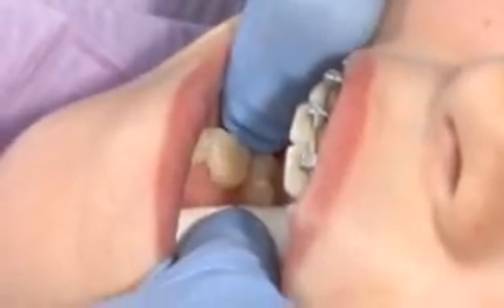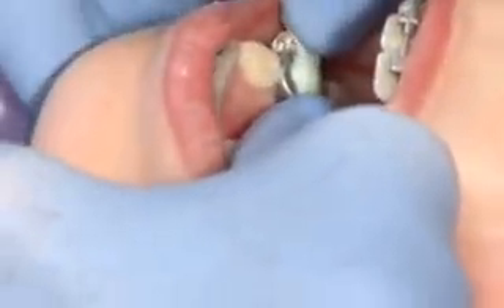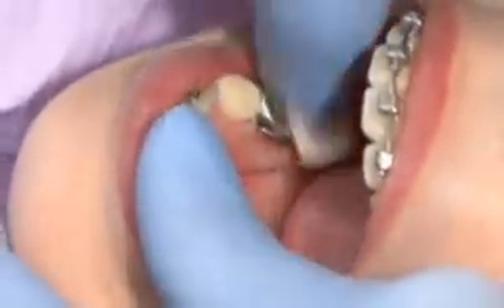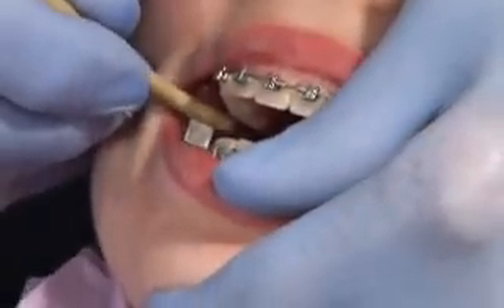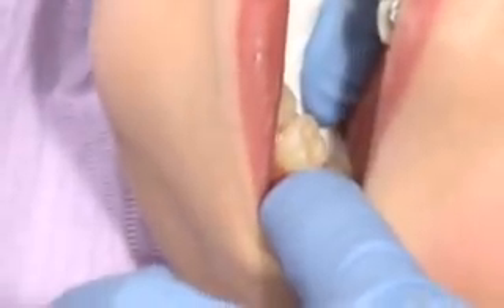If you're using a dual-cure adhesive and are delayed a few minutes before cementation, place an orange lightbox over the cement-filled crowns on the cold slab to keep the material from starting to cure too early because of the overhead lights. Cement the lower crowns first, then cement the upper crowns with the pre-attached mechanism.